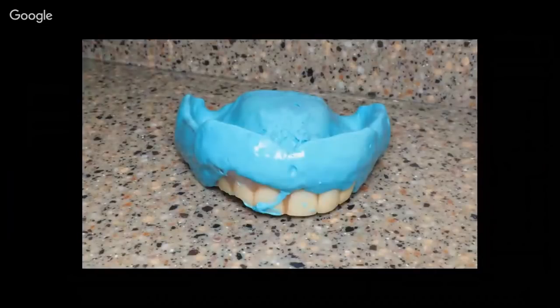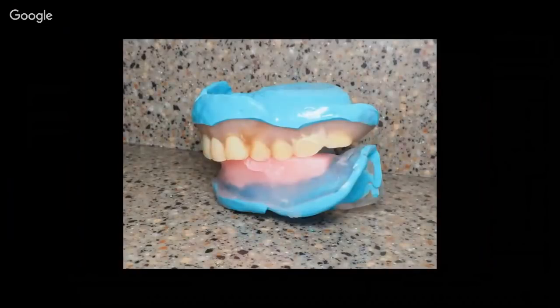And then we've got to get some way of recording the vertical. The patient had an existing upper, terrible though it was, so we just did a reline impression inside of that, and then we recorded a bite. You can see I've added wax, but I did not go to any effort to establish an occlusal plane or a bite rim on this, because there's a bit of an experiment going on. You'll see in a moment what I'm trying to do. For all intents and purposes, this is basically a mush bite. So I've got master impressions, upper and lower, and then a mush bite at the right VDO.